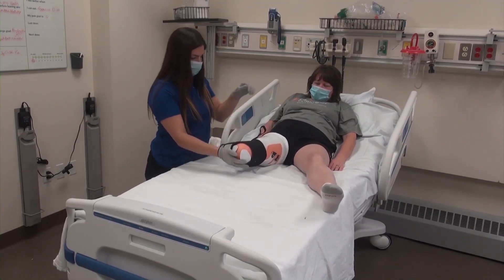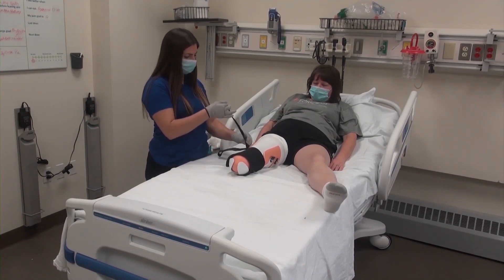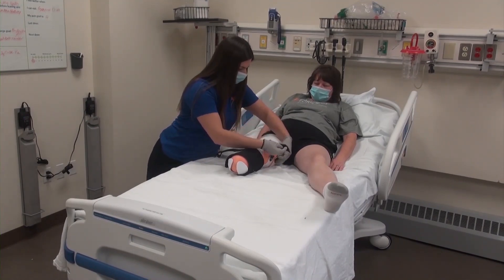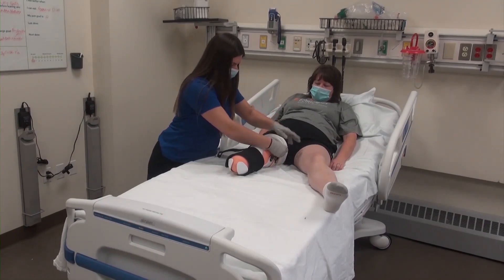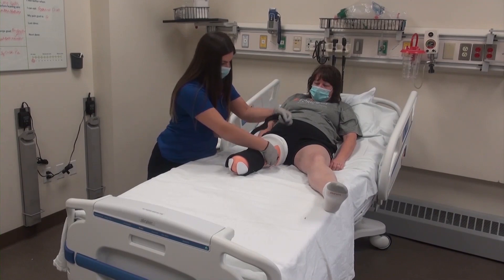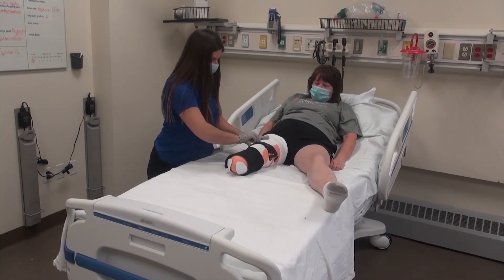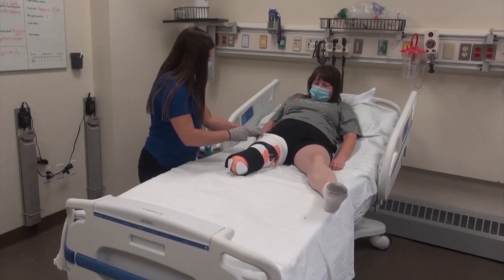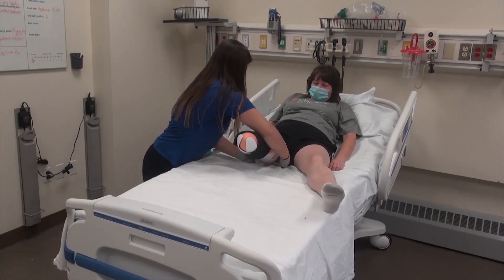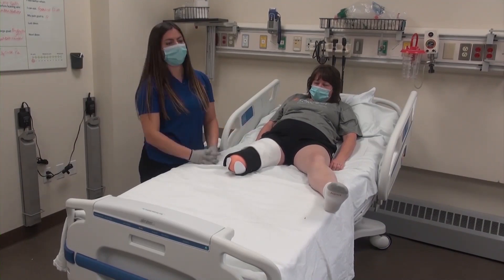At the proximal portion of the rigid removable dressing, the black straps will cross in an X pattern to secure the device to the patient's leg and assist with suspension when the patient is standing. Once the straps are secured, the top of the prosthetic sock may be folded over the straps for a more comfortable fit for the patient's upper leg.